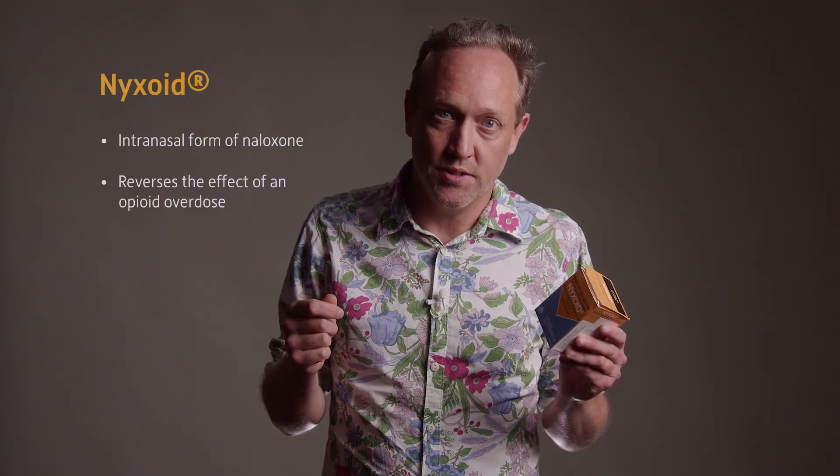In this video I'll give you a quick run-through of the naloxone medication Nyxoid, which is produced by Mundipharma. Nyxoid is a needle-free, ready-to-use intranasal form of naloxone, which is a medicine that works to reverse the effects of an opioid overdose.